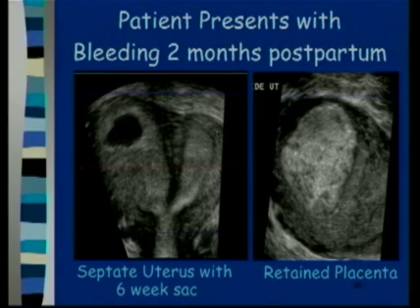These patients with uterine anomalies deliver early because the fetus just is ready to come out before. But she ended up with postpartum bleeding, and she had this large mass of echogenic tissue, and when she came in, I knew immediately that we needed a C-plane through her uterus to see the other picture and see whether there was anything in it.